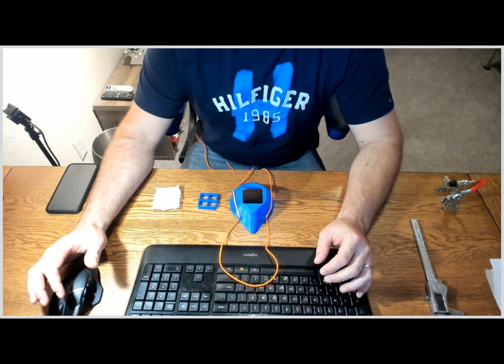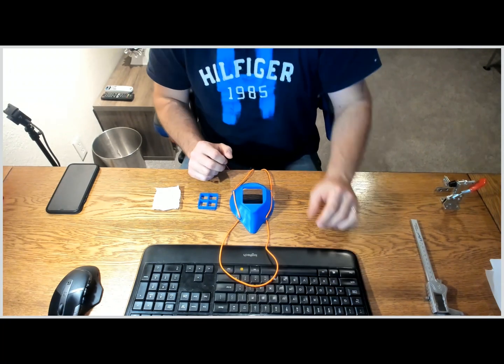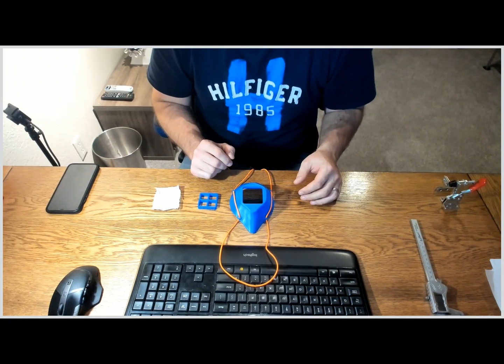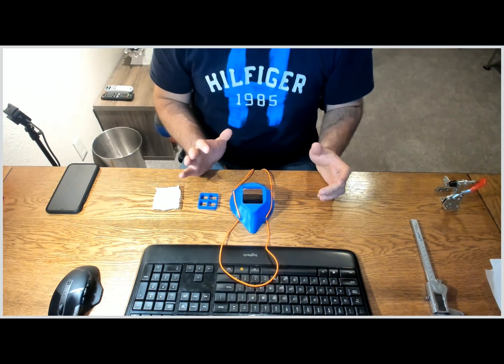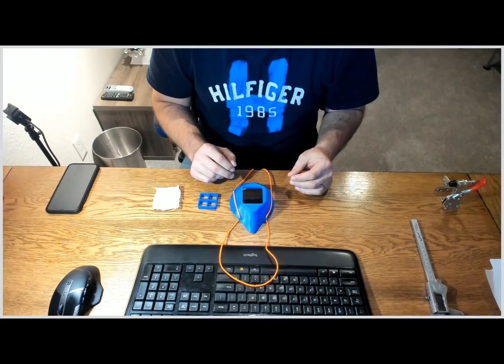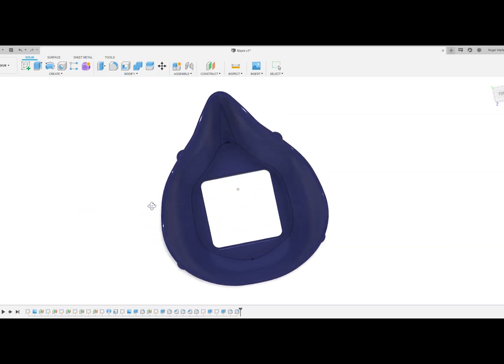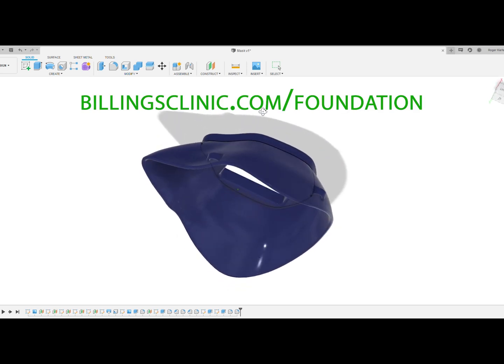Hi guys, so I came across a post asking for some help with printing these masks for staff and patients for the COVID-19 virus using a 3D printer. Someone much smarter than me came up with the design and they're open sourcing the 3D file. You can find a lot more information on billingsclinic.com slash foundation.